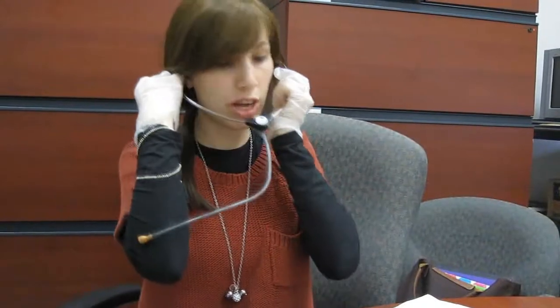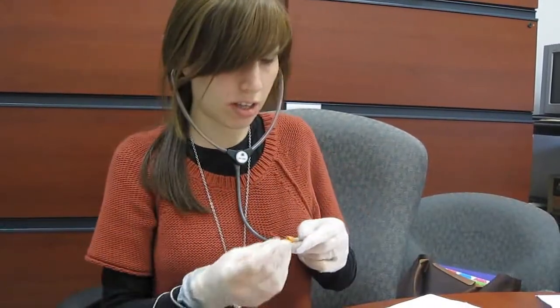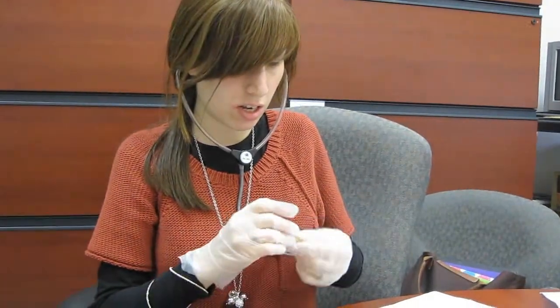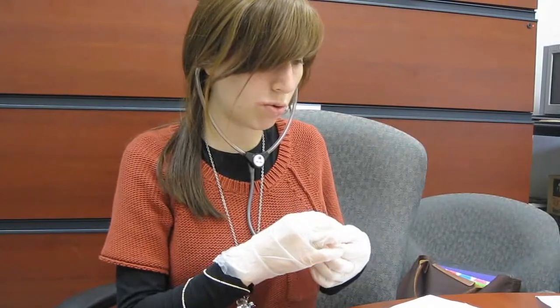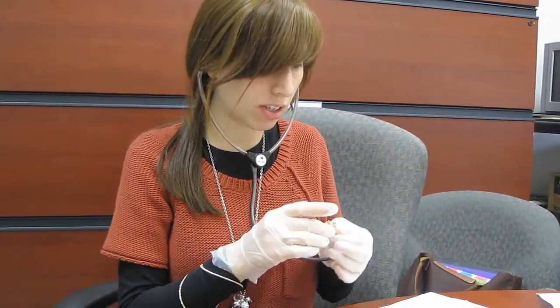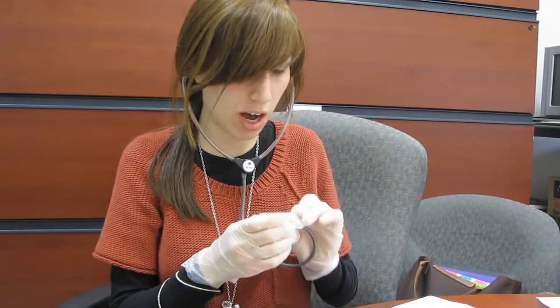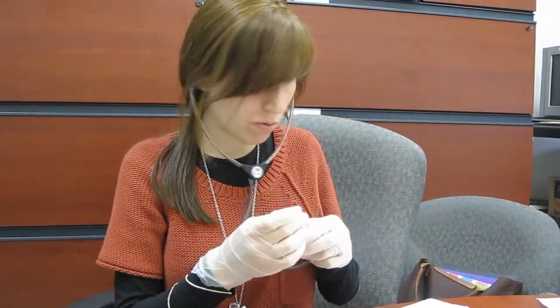Okay, and we're going to check with the 6 Ling sounds. We're going to connect this on. It's on. We're going to connect it. And we're going to check oo, ah, ee, s, sh, mm. I hear it. The signal is clear. There's no distortion, static, or hum. Now, we are going to put it in my hand, cupped, and I see that there's feedback, so we know that the battery is working.